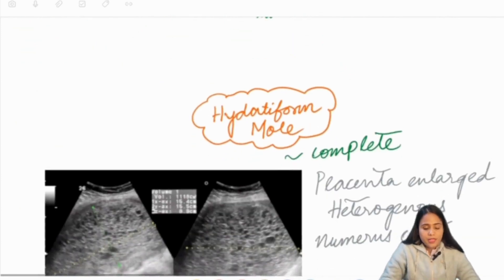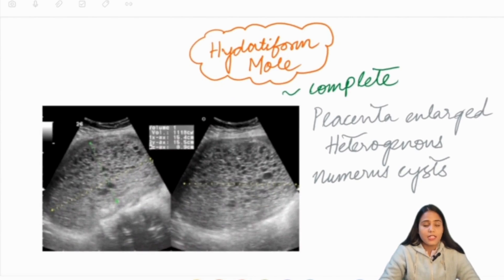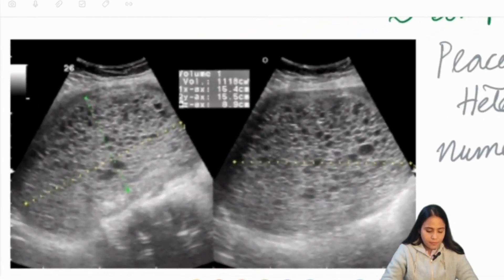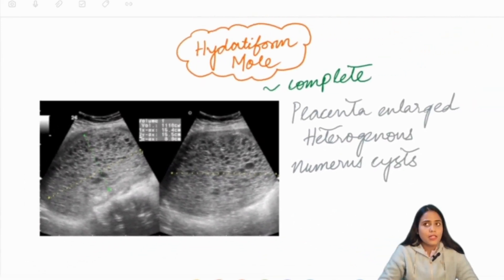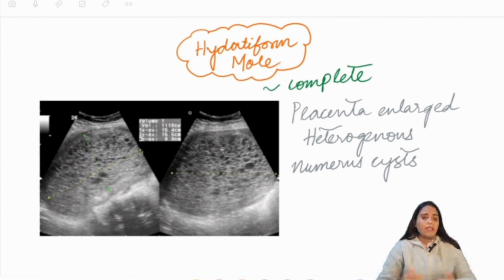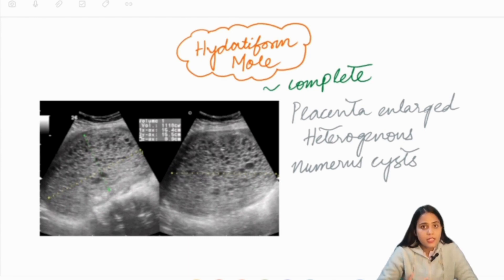Number one is the hydatidiform mole, seen in a complete hydatidiform mole. The placenta is grossly enlarged, appearing very heterogeneous with innumerable cysts throughout the parenchyma of the placenta. The embryonic pole is almost destroyed. The patient can have increased vomiting and passage of grape-like vesicles per vagina. The numerous cysts seen are secondary to the numerous hydropic villi formed, filling up almost the entire uterine cavity.